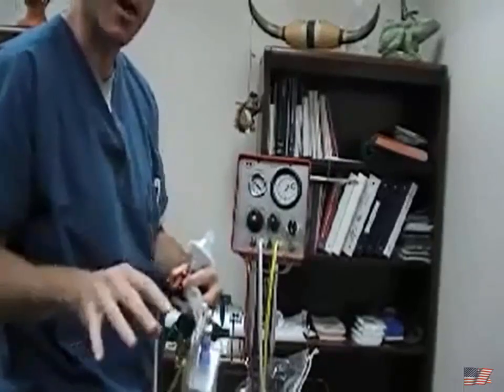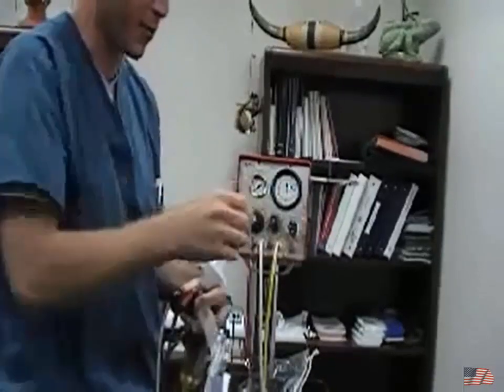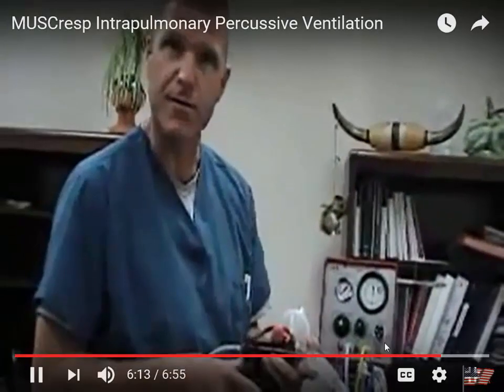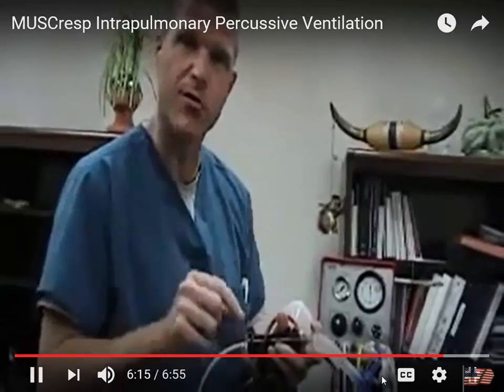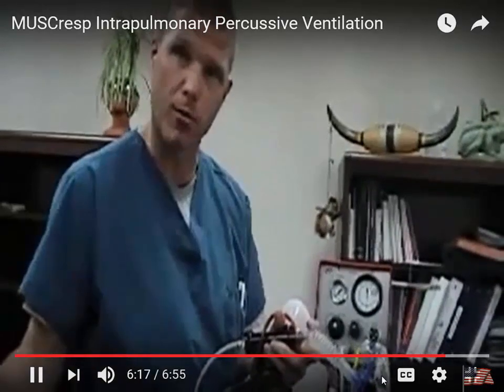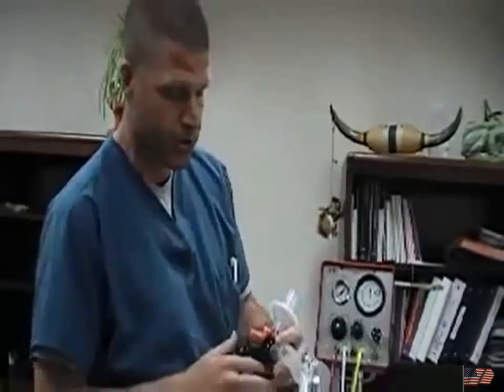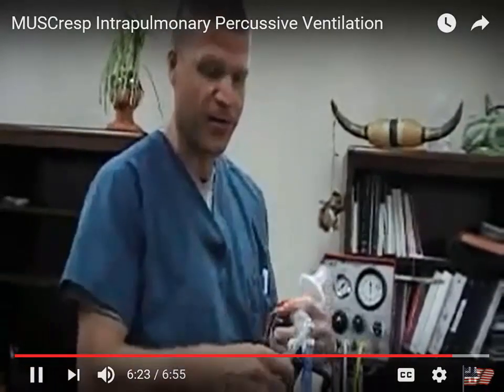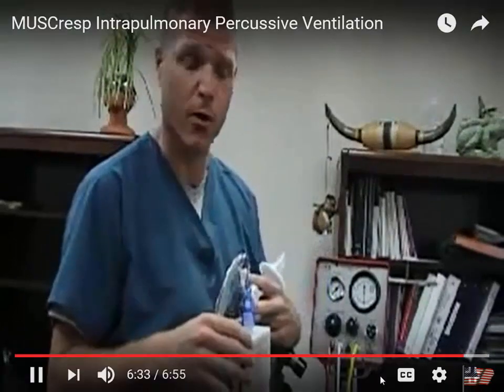Typically, our treatments will last 15 minutes. Okay, so make sure you put enough solution in here of whatever you're nebulizing, for at least 15 minutes, and it usually nebulizes 1 mil per minute. Now, when we're done with the treatment, we're going to have to obviously suction the patient out, and if there's any secretions that come up through the breathing tube at that point, we can suction them out with our closed suction system, or if most of the secretions will come up through the oropharynx, we'll just suction out the back of their throat.